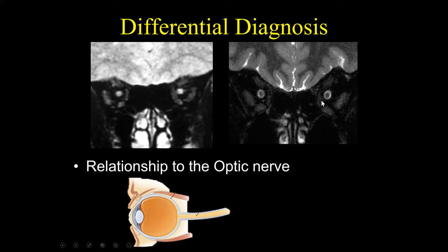Now with heavily T2-weighted images, we should be able to see a much greater level of detail. If you are looking at orbital studies, I encourage you to always do coronal T2-weighted images with fat suppression. You should be able to see this level of clarity and also see the anterior skull base and the gyrus rectus.